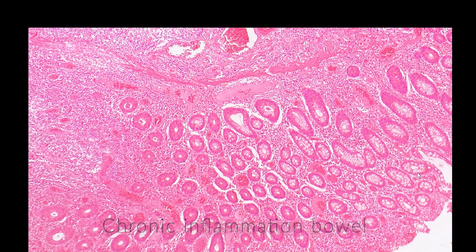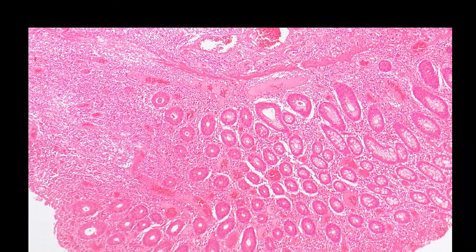So let's look at chronic inflammation. The major difference here is in the type of leukocytes that's present. So instead of neutrophils, we have a predominance of mononuclear cells, particularly lymphocytes, usually a scattering of plasma cells as well. This is again a section of bowel. You can see once more the normal columnar epithelial cells, tall columnar cells with occasional goblet cells, that clearing.